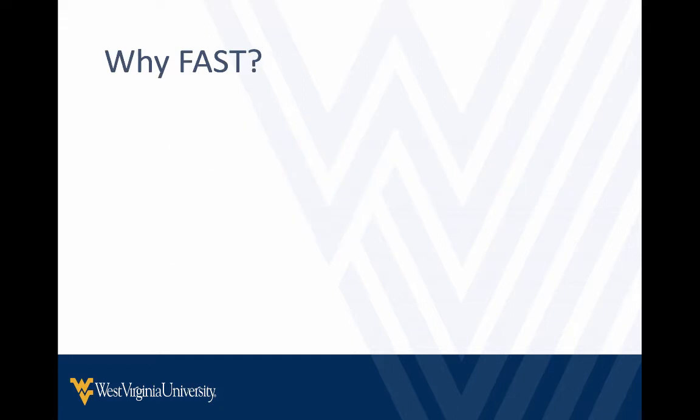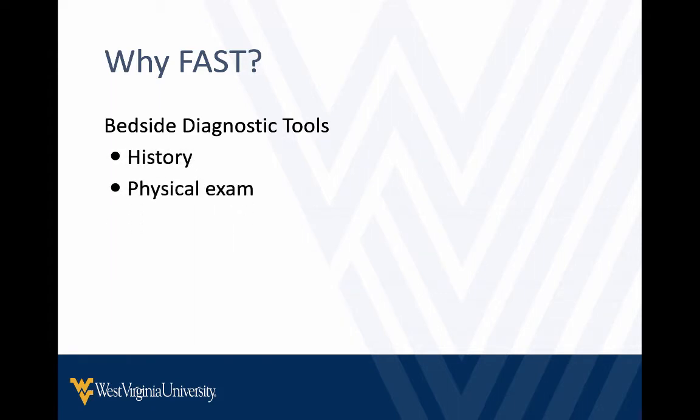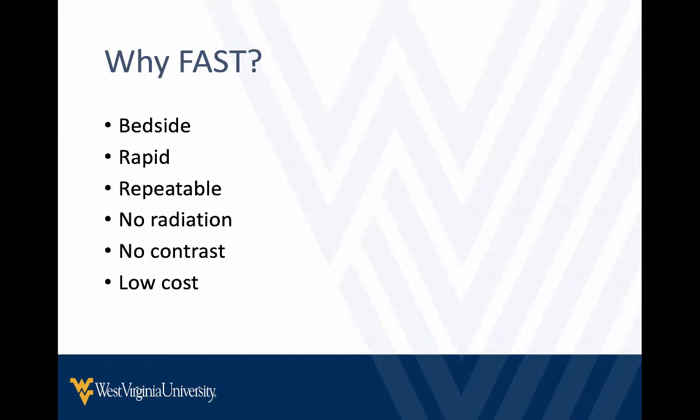So a little bit about why we would do the FAST exam. If you think about trauma, when your patient rolls into the trauma bay, the things you have at your disposal are history and physical, maybe a DPL, not done a whole lot anymore. The FAST can add to that history and physical exam at the bedside. It's rapid, we can repeat it, there's no radiation, contrast, it's low cost.